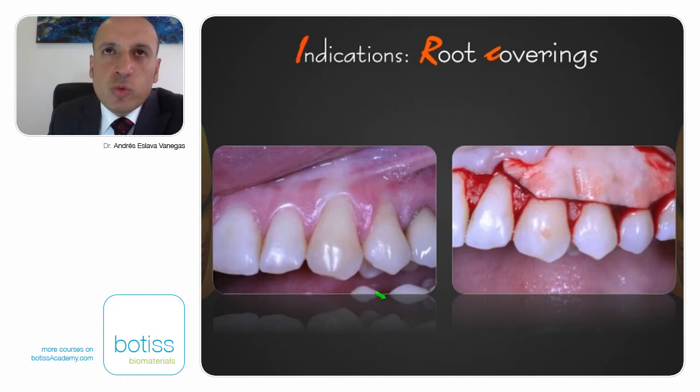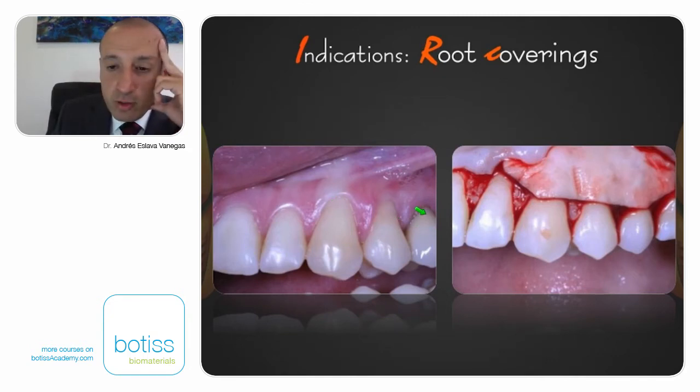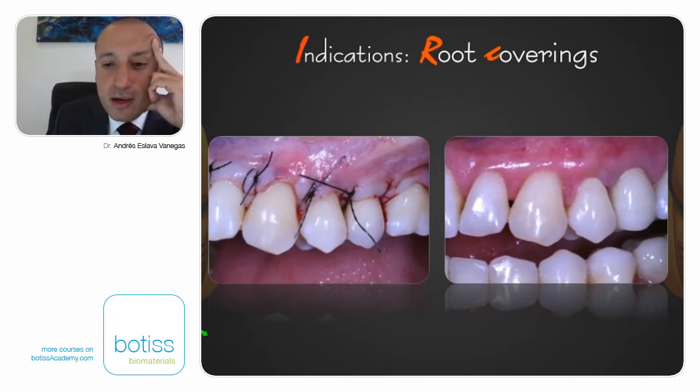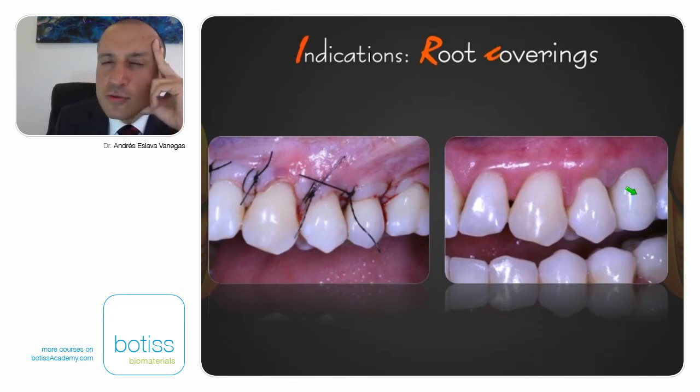You're going to see cases where we're using dermal graft for about 10 years, and we're going to see from simple cases to very complex cases. You can see here a patient that has root gingival recessions here in the canine and the premolars. Even here is a crown. And at the beginning, we were using dermal matrix that was human source. We make a mucosal flap, and we cover. And you can see here, 2 years after the surgery, what is the recovery of that surgery.